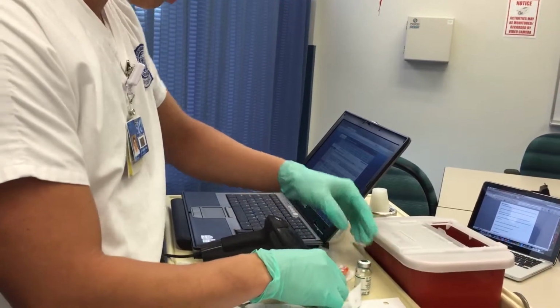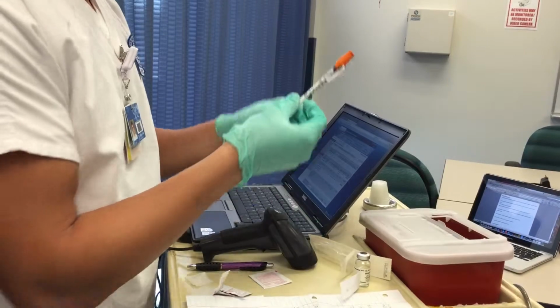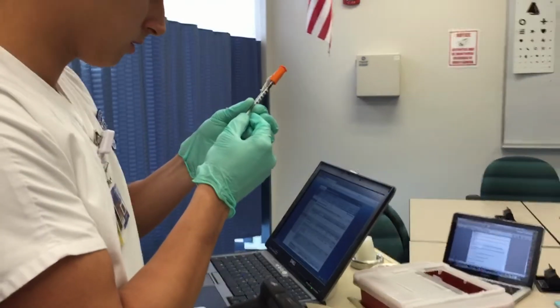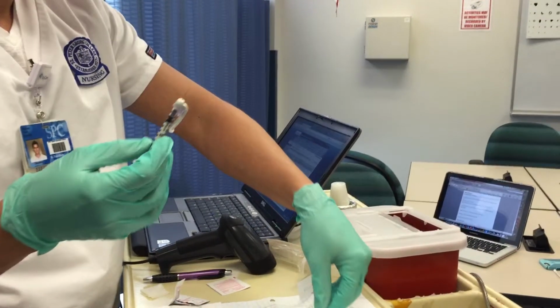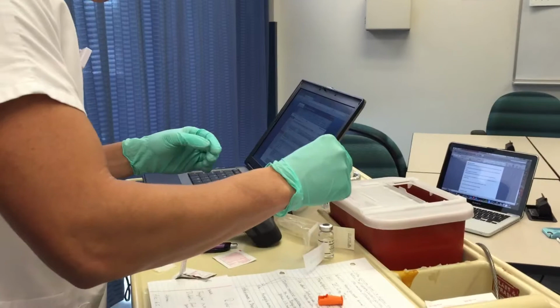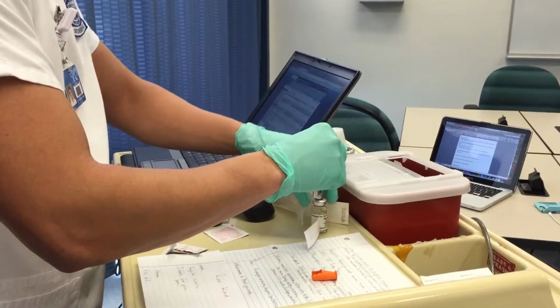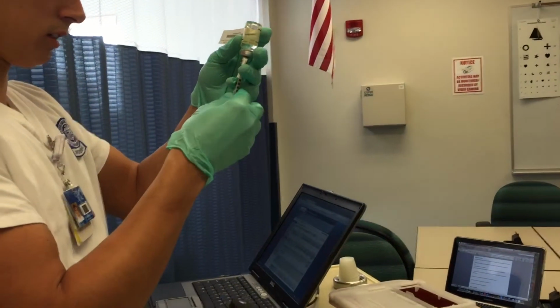Just need to make sure the insulin is right. So I'm going to draw 16 units, and insert into the vial. Now I draw 16 units.